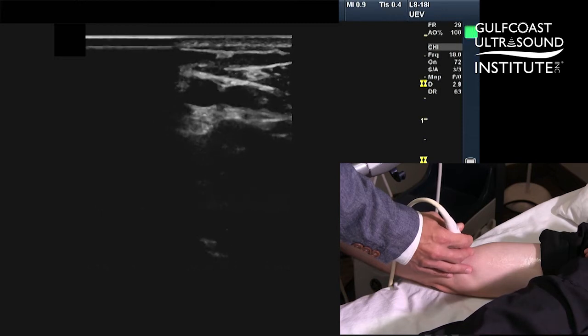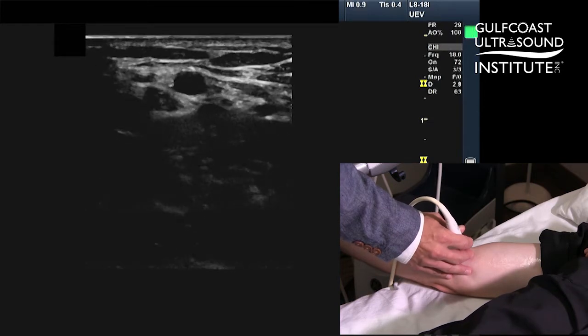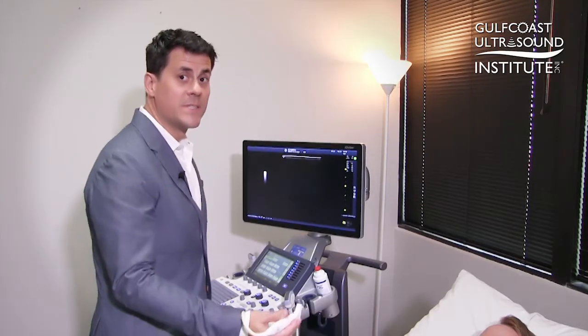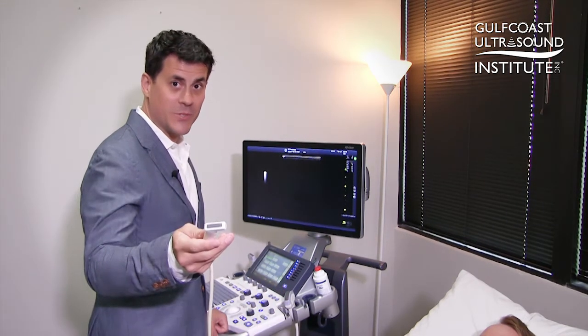No pressure at all — I don't even have full contact on the edge of the screen. Put just a little bit of pressure: the vein gets smaller, collapses, and the artery pulsates. So that's how you can tell the difference between an artery and a vein to make sure you're cannulating the proper vessel. That's your hot tip for the day — give it a try.